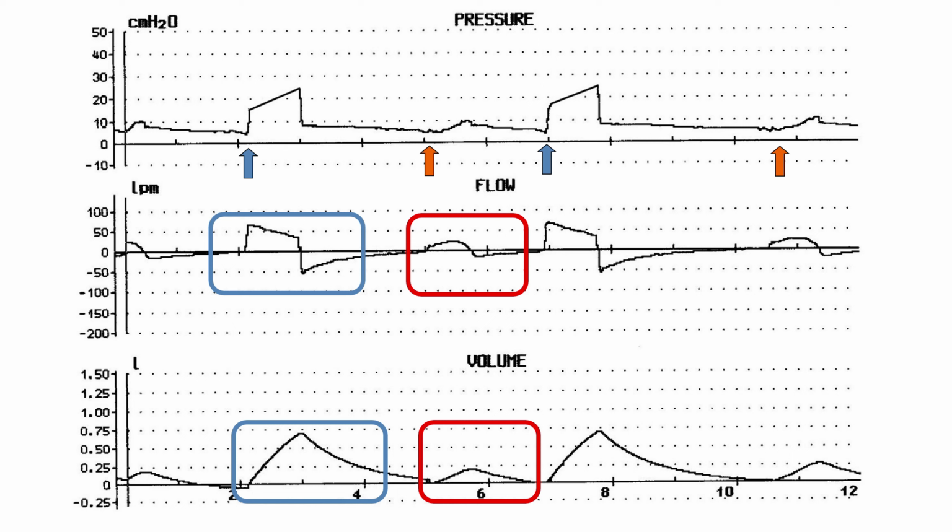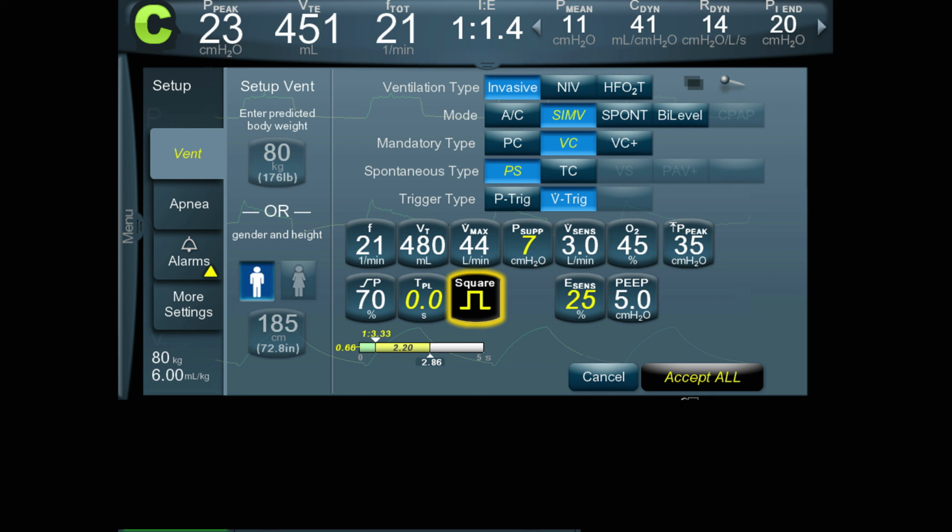And that suggests that the patient is working fairly hard when breathing spontaneously without additional support. And hence, this is the reason why pressure support was created: to help that spontaneous breath, just to push it up into a window where the patient doesn't have to work.